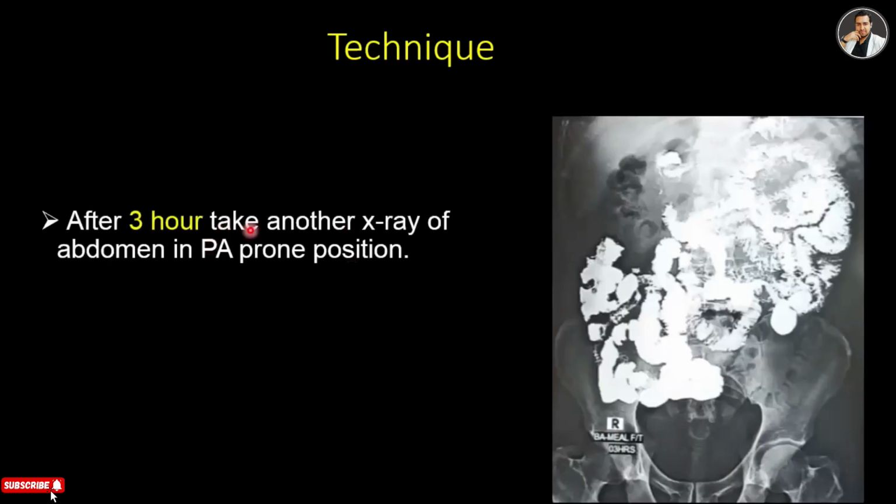And then after 3 hours, take another X-ray of the abdomen in PA prone position, and you can see that the contrast has gone through all the small intestine and starts reaching the large intestine. So this is a 3 hour image.